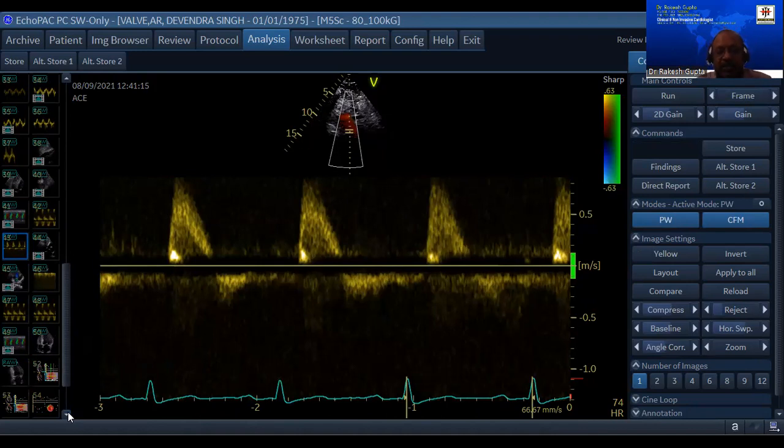Whether it's mitral, whether it's aortic, the vena contracta always plays a significant role. Vena contracta of mitral regurgitation would be in systole and of aortic regurgitation would be in diastole. So you'll have to spend time in both these views, and in both MR and AR, you have to have LV dilatation. In MR, we had LA area versus jet area. Here in AR, we have jet width height over LVOT height.